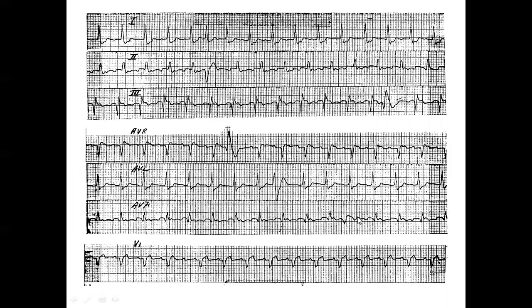Sloping up, slanting down, then dips, sloping up, slanting down, then dip. If you don't recognize this as a flutter wave, you will never call this a flutter wave. That is, you have to recognize me. Then you can say, oh, that's Dr. Wang walking down there. If you don't recognize me, you never can call, oh, that's Dr. Wang. You know what I mean?